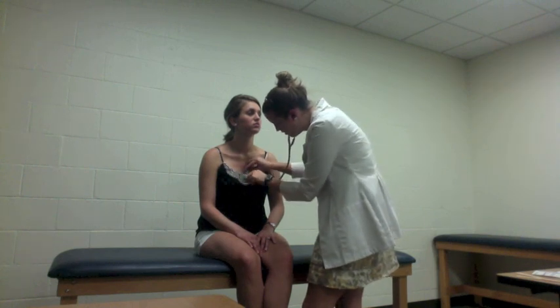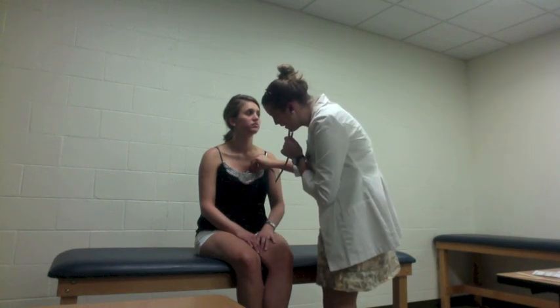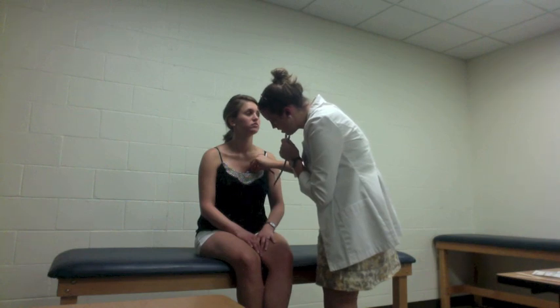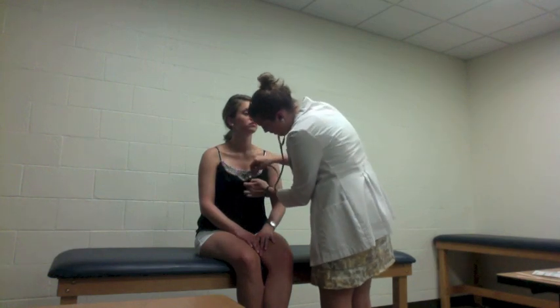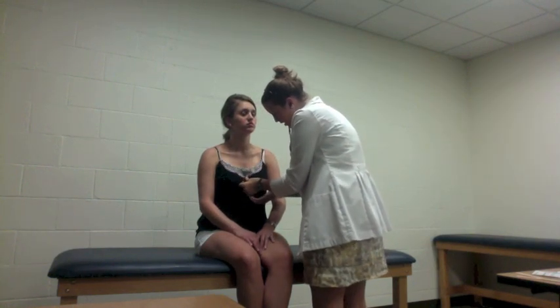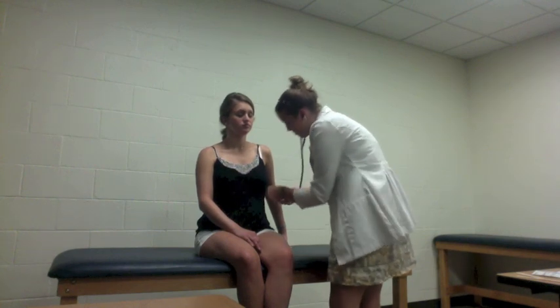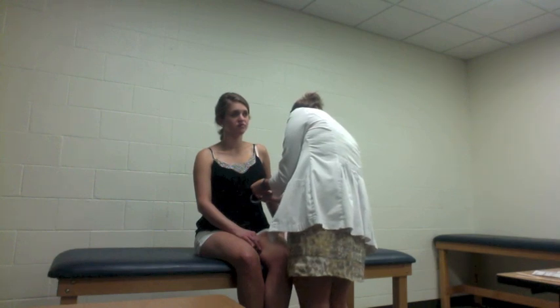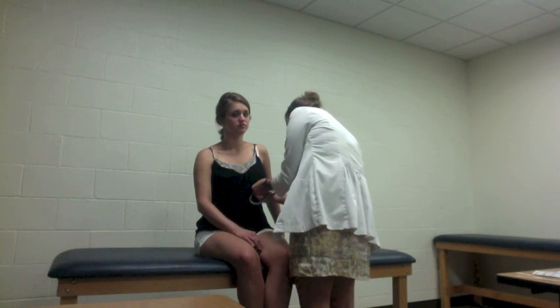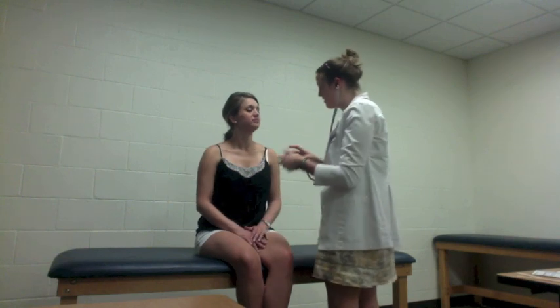Perfect. I'll move down to the third intercostal space, left sternal border. That's Erb's point, or the second pulmonic. Okay, I'm just going to touch you, just a second. Okay, I'm going to go to the fifth intercostal space. I'm just going to lift up your bra here. Okay, this is your tricuspid. And then I'm going to do your mitral area. I'm going to lift up your bra again, okay? And this is the apex of your heart, so your S1 is heard the loudest. Okay, and then I'm going to listen to all those with the bell of my stethoscope as well.